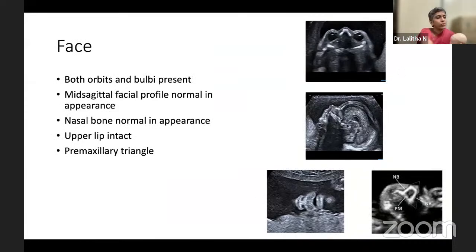So moving down to the fetal head. You've imaged the fetal head, then immediately you turn your probe, and you can see the fetal face. Okay, so this is the fetal face. You can look at the axial part of the fetal face that is imaged in the topmost image, where you're seeing both the orbits with the lens and the nose. So this is the orbital image.